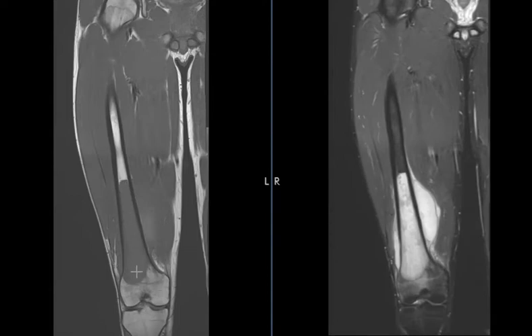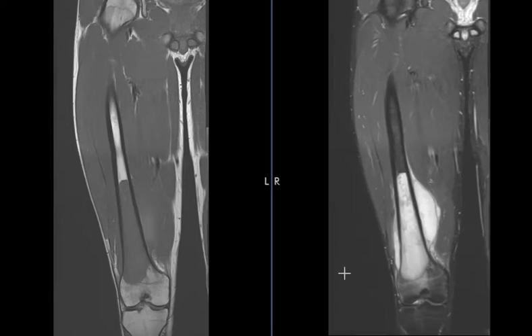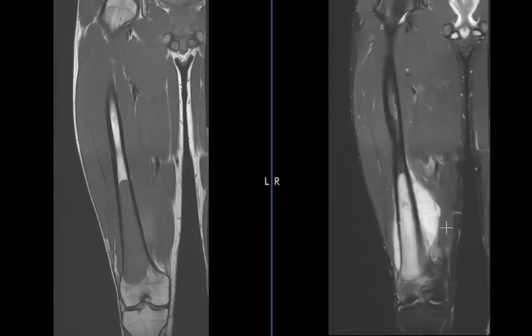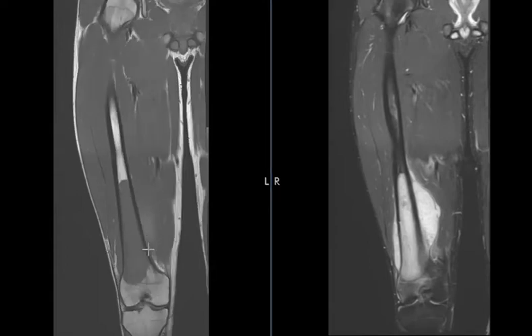This is called a fat-suppressed T2 or STIR image. They look very similar, and we see a large bone tumor in the femur with a large soft tissue component. The cortex actually looks pretty good — there's not a lot of bone destruction. Often when bone tumors are this big, the cortex, which is the black line, will be absent or markedly irregular.